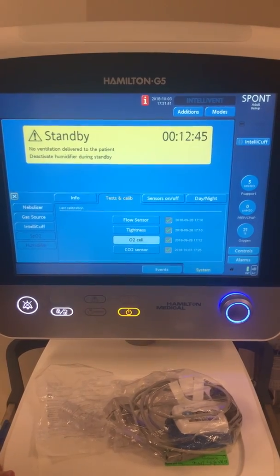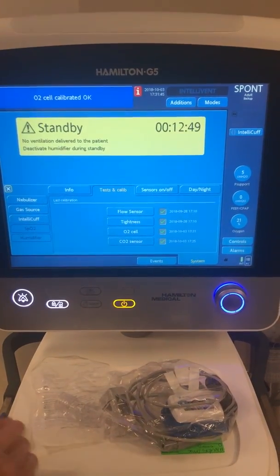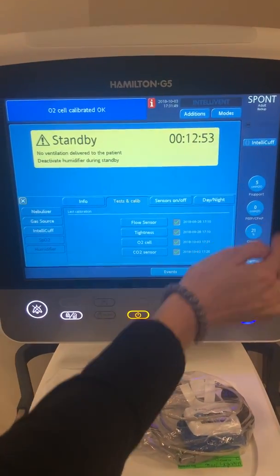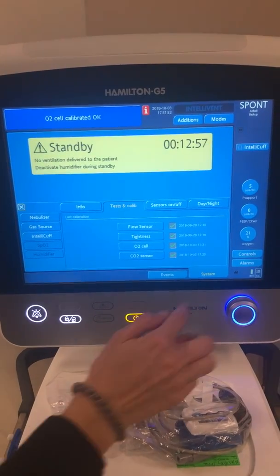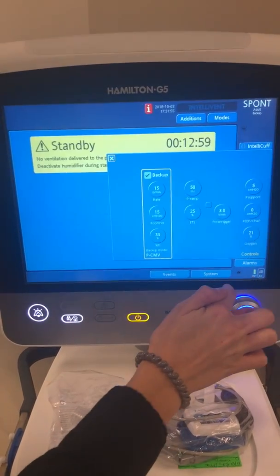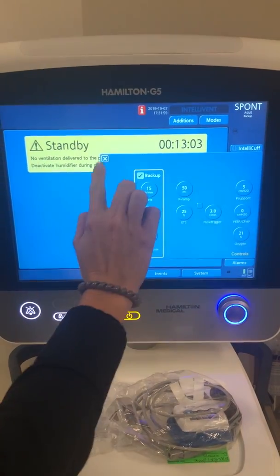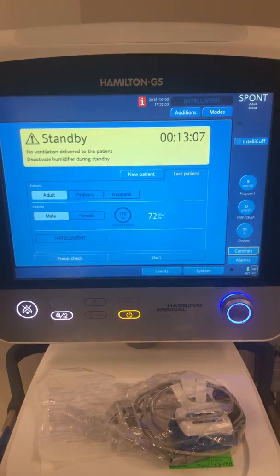And then just for the purpose of us breathing on this machine, we're going to have it in pressure support. But that's obviously not the way that you would go about it on your patient. We're going to do PEEP 0, pressure support of 5, just to make it easy on Melissa. So we'll take our controls. They're all good. We're happy with that. And we can go back and we'll start ventilation, and I'll show you how to set it up once it's on.